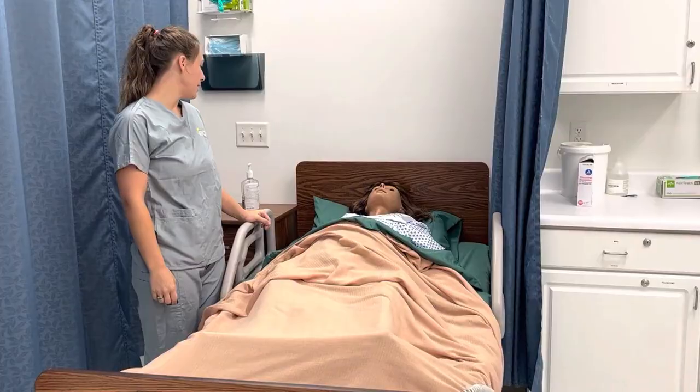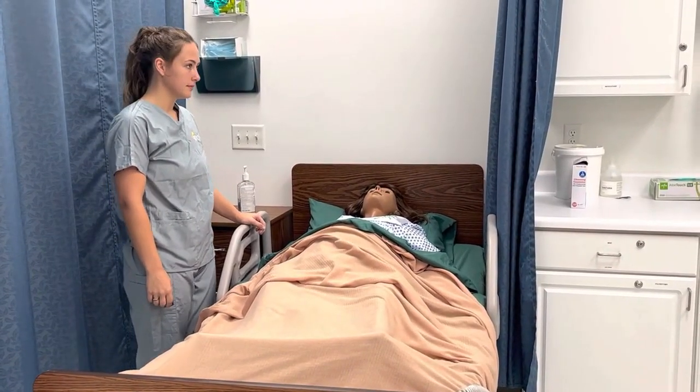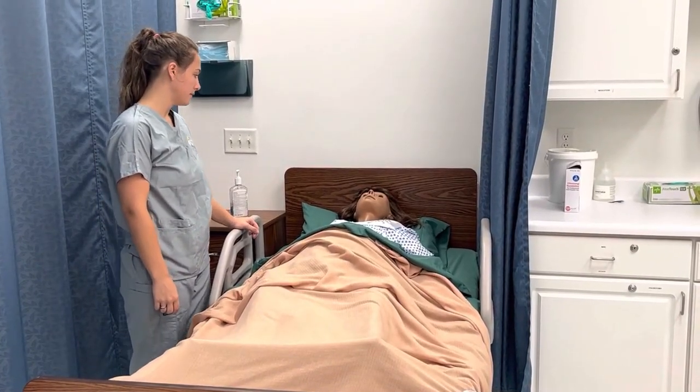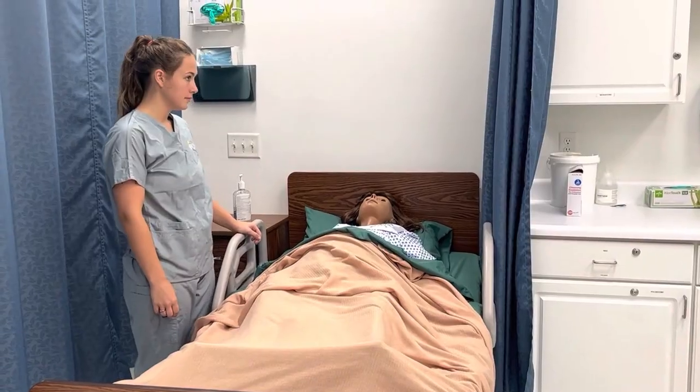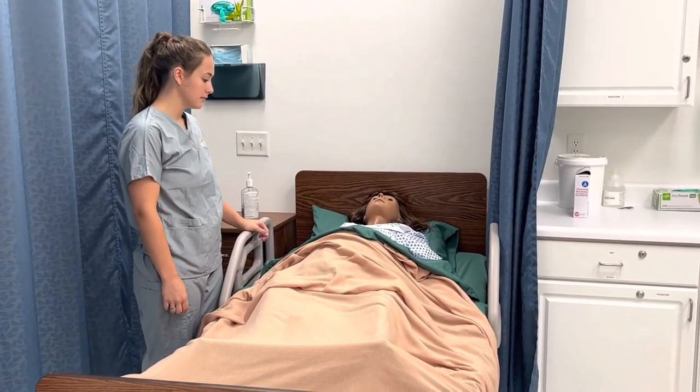Hi Annie, can you tell me your name and date of birth for me? The next step the nursing student should do is explain to the patient that we are going to be assessing her fundal height and that it won't take very long at all. Some questions that should be asked are, is your bladder empty? If not, the patient should get up and void.